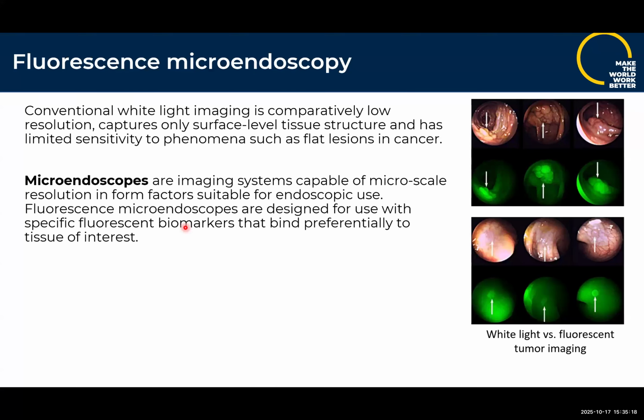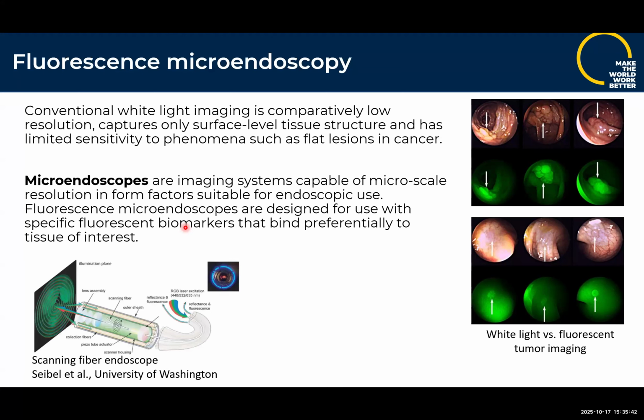And these appear much more brightly if you can apply a fluorescence biomarker and then detect fluorescence emitted by that system. So a lot of work that Tom does is on molecular probes that preferentially bind to cancer tissue and bring a fluorescent molecule with it in order to be detected in the optical instruments. There are systems to try to do fluorescence imaging already.